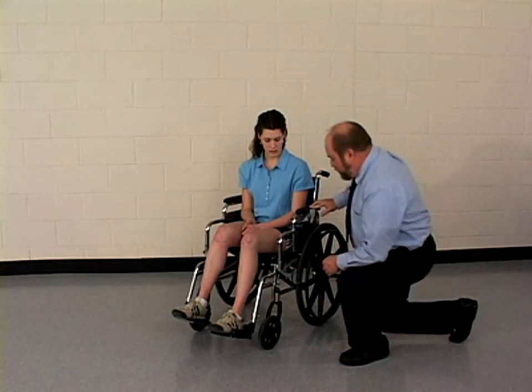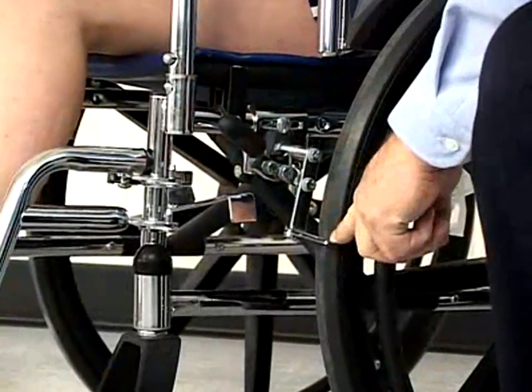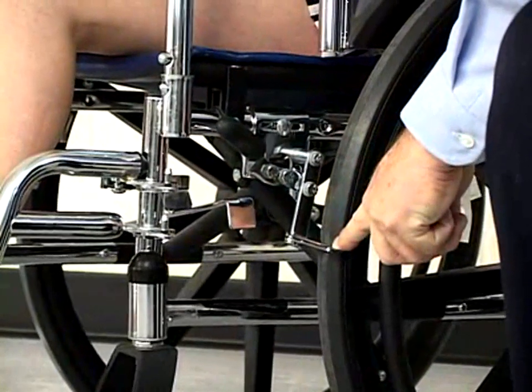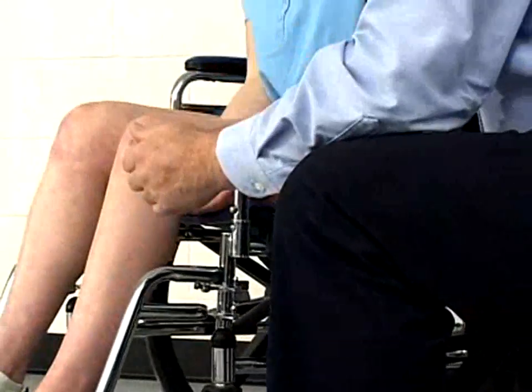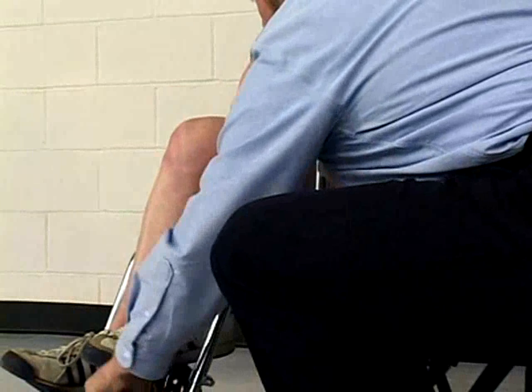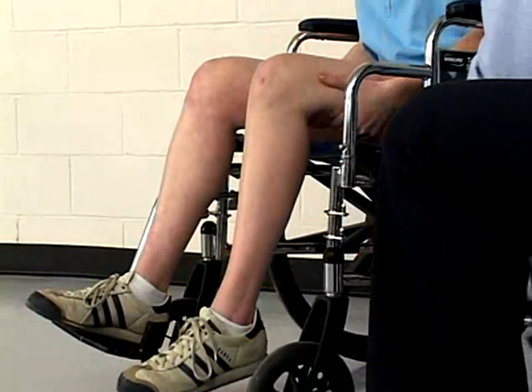When a patient is assuming standing from or assuming sitting in a wheelchair, the chair should first be stabilized. Make sure that the wheel locks are engaged and the wheelchair is placed against a stable surface, if possible. Footplates should be raised and the footrests removed and placed out of the way of the therapist and the patient.